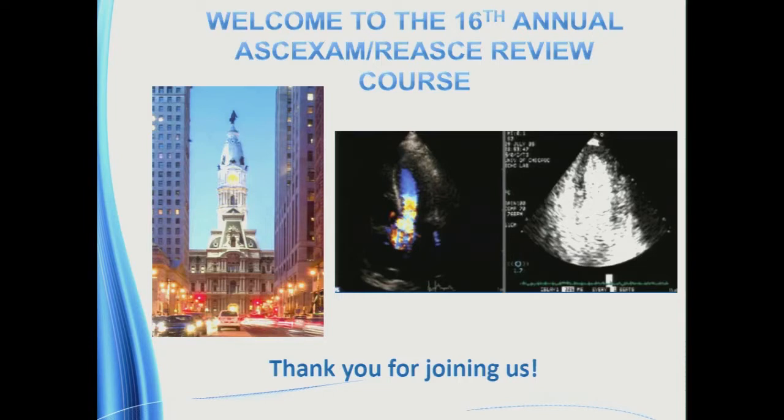For left atrial appendage thrombus, does it have to be the same density of the tissue, and how do you differentiate sludge from clot? That's a good question. First of all, it generally is close to the tissue density. Sludge versus clot. I've gotten fooled before.